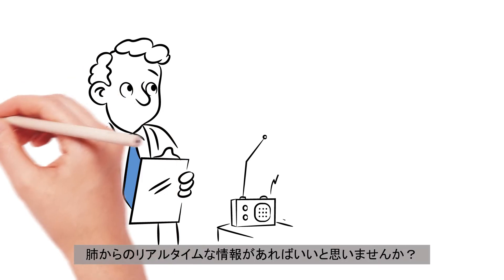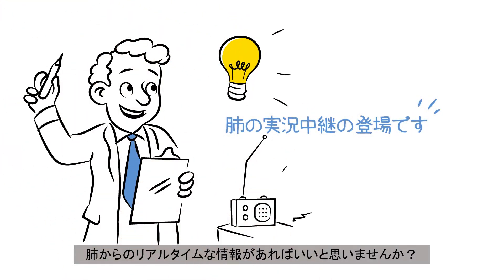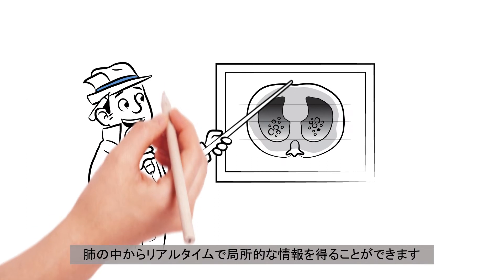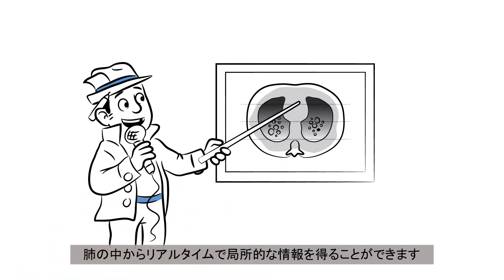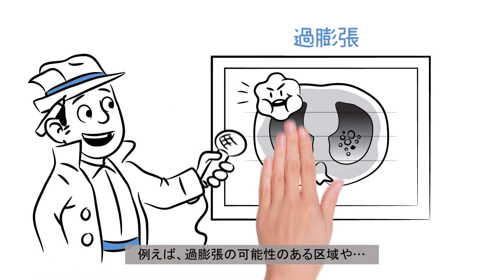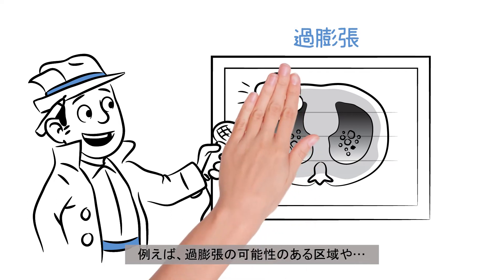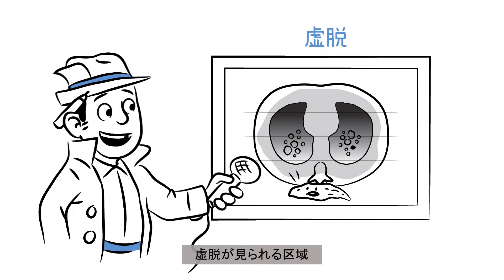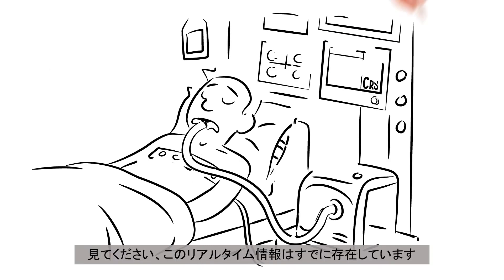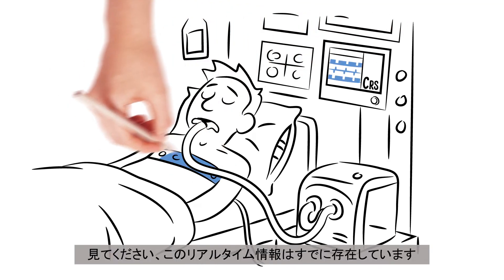Wouldn't it be perfect to have a live report directly from the lung? You would get live regional information in real time out of the lung — for example, about areas of possible overdistension or collapsed areas in the lung. Guess what? This live broadcast already exists.